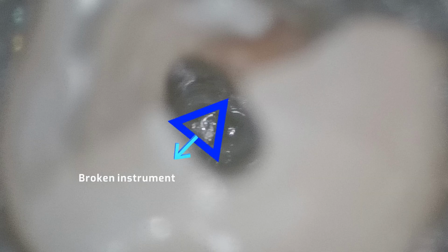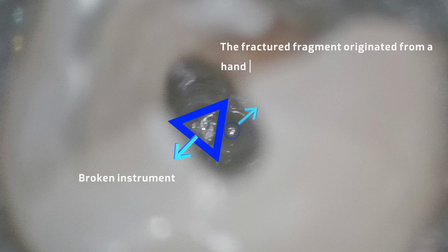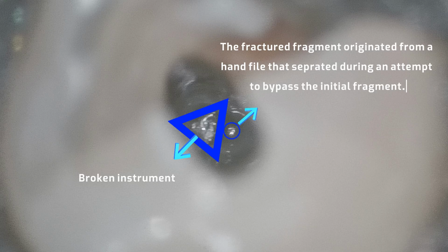Broken instrument. The fractured fragment originated from a hand file that separated during an attempt to bypass the initial fragment.